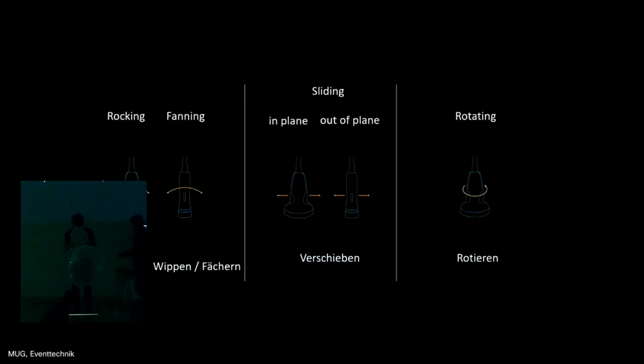And we make sure you won't fall out of stage. No worries. Mostly it works. Okay, Sammy, please lift up the probe. Great. Okay, Sammy, we will give you some instructions and we will guarantee you will be successful without even seeing.